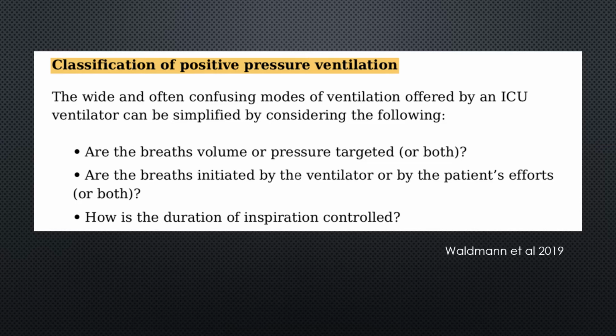The second question is, are the breaths initiated by the ventilator or by the patient's efforts, or both? Breaths can be delivered according to a set frequency, which is known as ventilator or mandatory breaths, or in response to the patient making an attempt to inhale. Some modes allow a mixture of mandatory and spontaneous breaths.